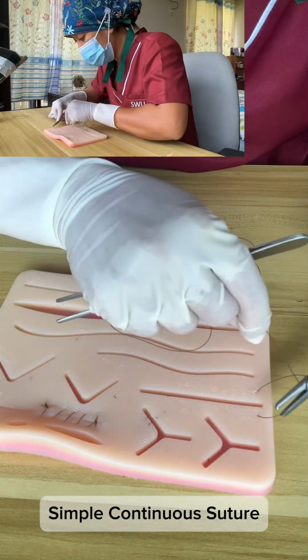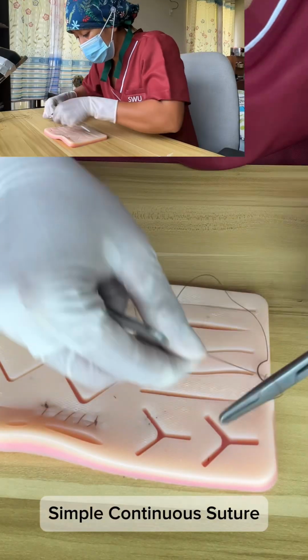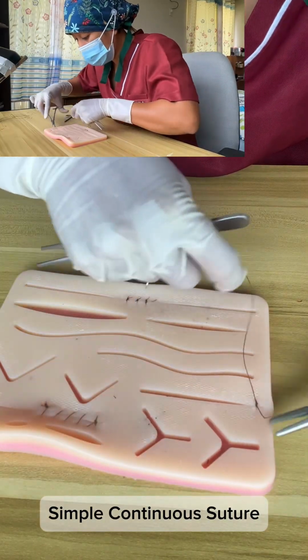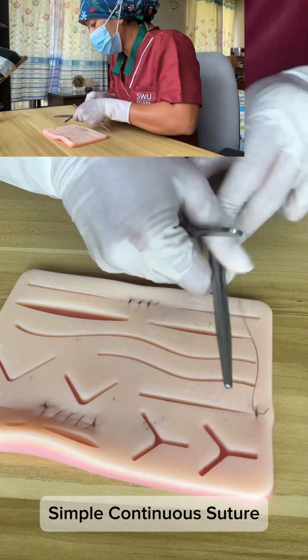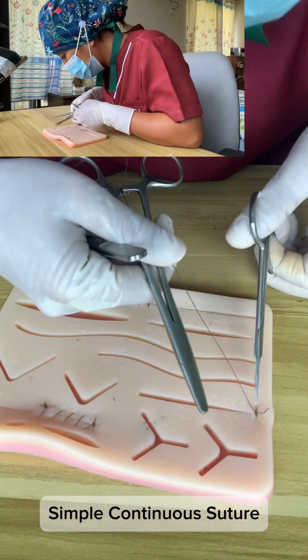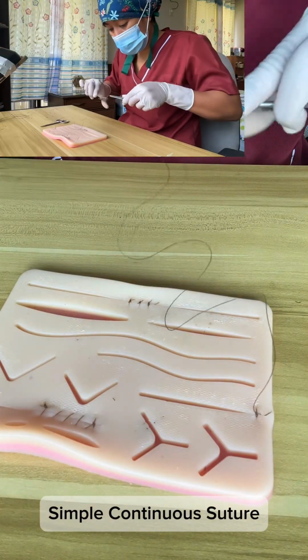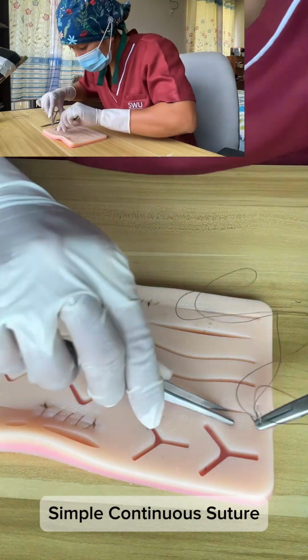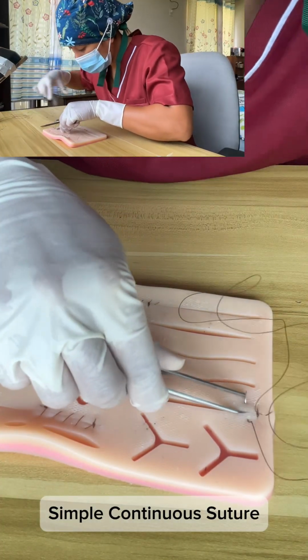Simple continuous suture is appropriate for certain tissue because it provides quick closure of long incisions. It distributes tension evenly along the wound, reducing the risk of tissue strangulation. It uses less suture material than interrupted sutures. And lastly, it gives a tight, leak-resistant seal, which is useful in low-tension tissues and internal layers.